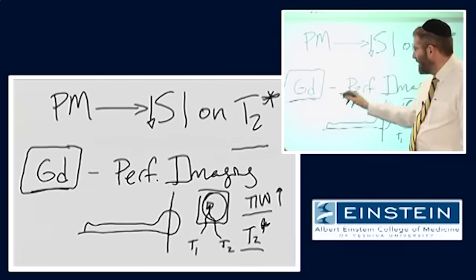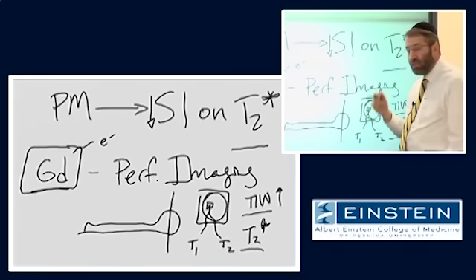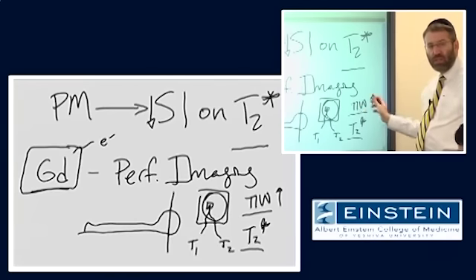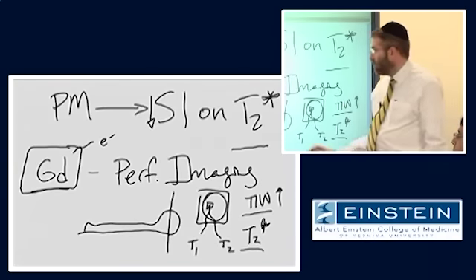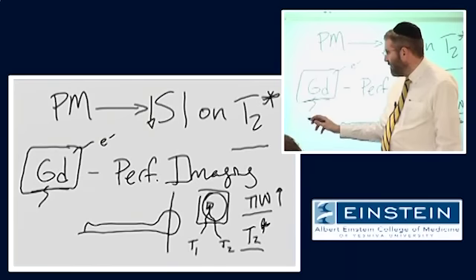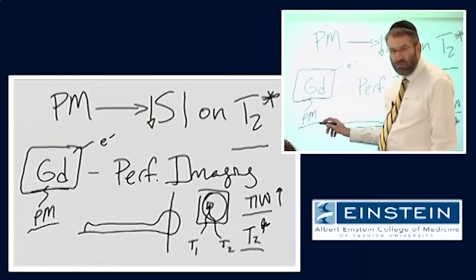Well, we're using gadolinium as our contrast agent. We've already said that gadolinium has many unpaired electrons, and that as a result of that, first of all, those unpaired electrons can lead to this proton-electron dipole interaction and cause shortening of T1, but they also lead to gadolinium having a very high degree of paramagnetism.